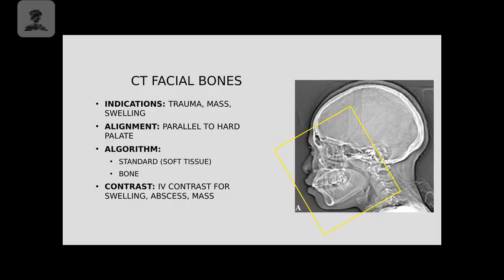If they are laying on their belly with their chin extended out, then we actually want to be perpendicular to the patient, their hard palate. So in this situation, here's their hard palate. And so we would want to be perpendicular to that. So our patient's pretty dang close to that.